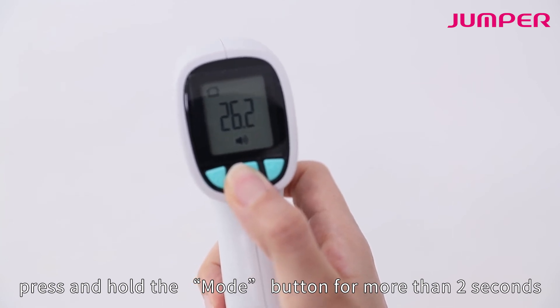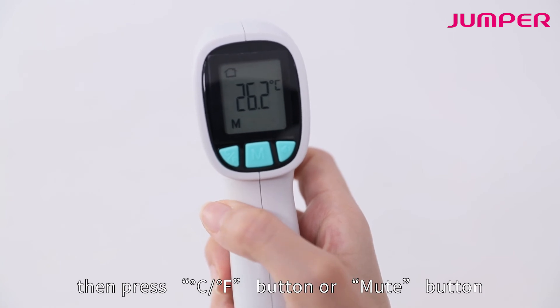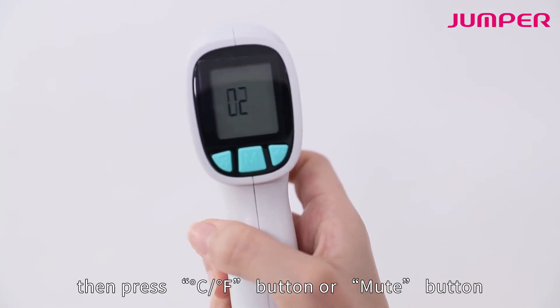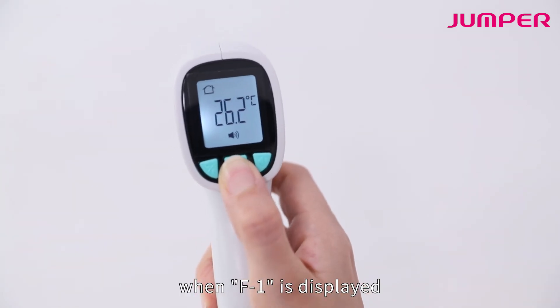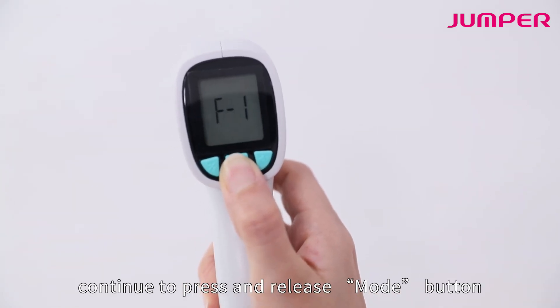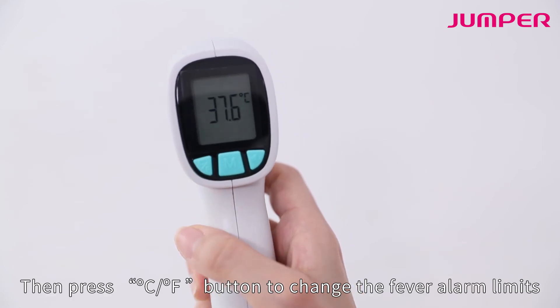In the power-on state, press and hold the mode button for more than two seconds until F1 is displayed. Then press the CF button or mute button to check the records. Continue pressing and releasing the mode button until F2 is displayed.